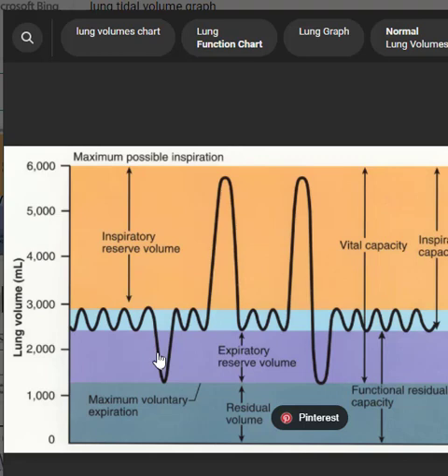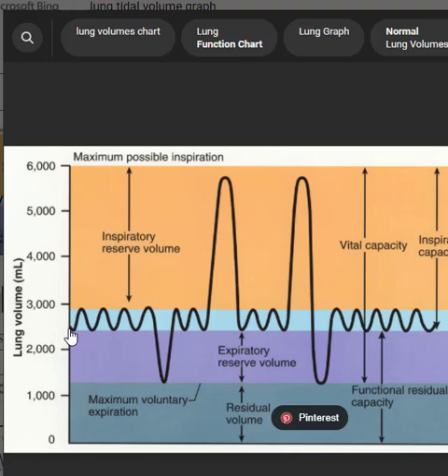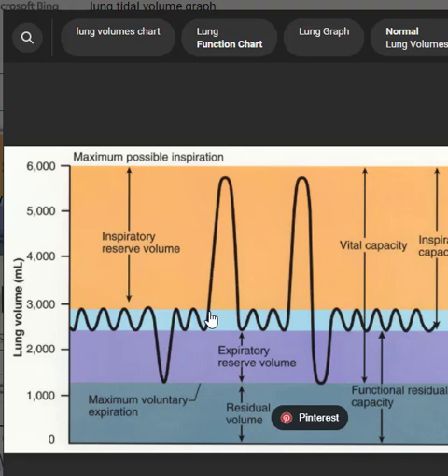Then you say 'breathe out as much as you possibly can.' Here's your tidal volume going down, but instead of stopping and taking another breath you keep pushing until you get the maximum amount out — that's your expiratory reserve volume. You measure it from the bottom of tidal down to the lowest point. Starting at about 2,500 and going down to about 1,000, this person has an expiratory reserve volume of about 1,500 milliliters.